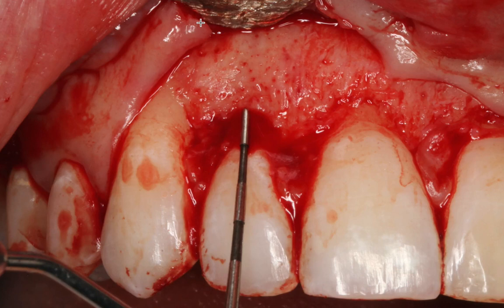Now, even if you're seeing that the bone level is at the right height, you may be tempted just to replace the tissue back without doing anything with the bone, and that would probably be a mistake because your tissue will regenerate because you didn't address the horizontal dimension of bone, and that's what we call festooning. It's extremely critical. We go over this in the crown lengthening course.